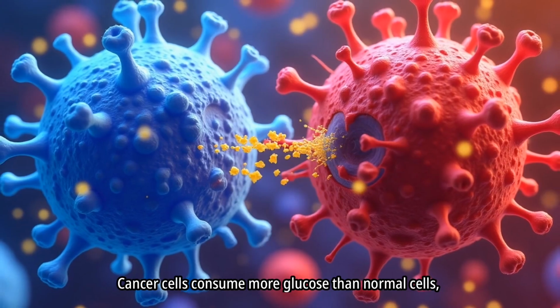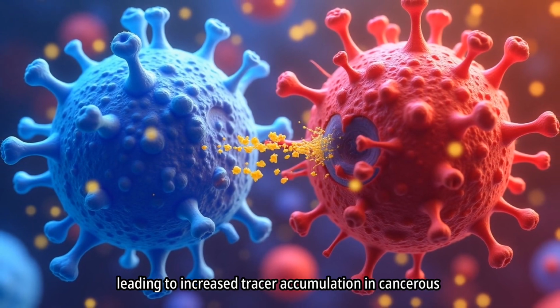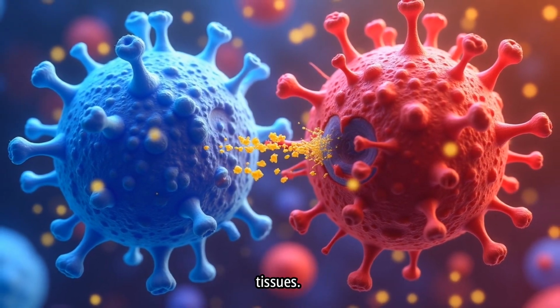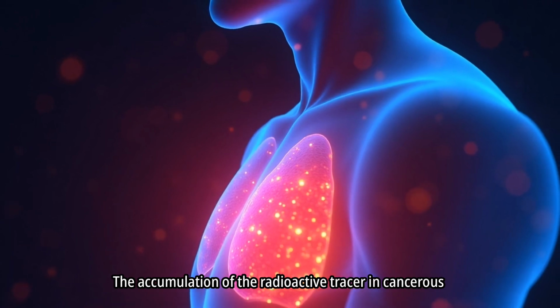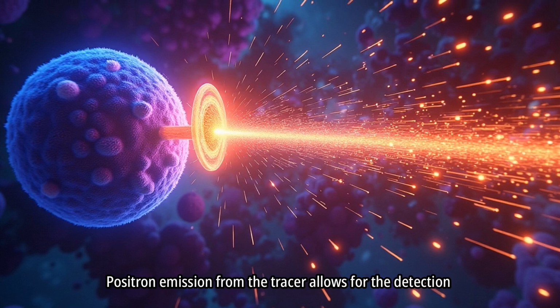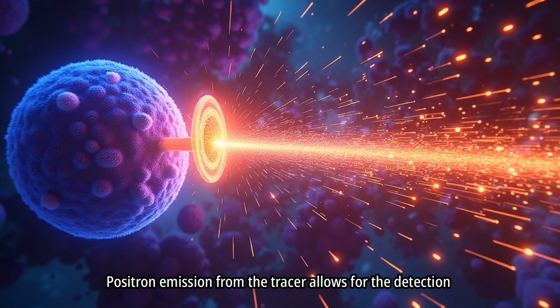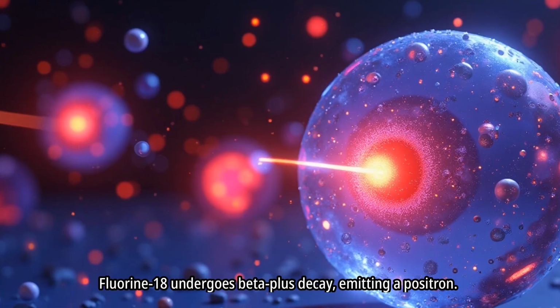Cancer cells consume more glucose than normal cells, leading to increased tracer accumulation in cancerous tissues. The accumulation of the radioactive tracer in cancerous tissues is a key factor in PET scan imaging. Positron emission from the tracer allows for the detection and localization of cancerous tissues.